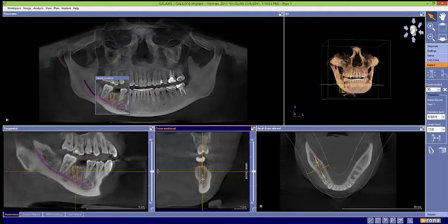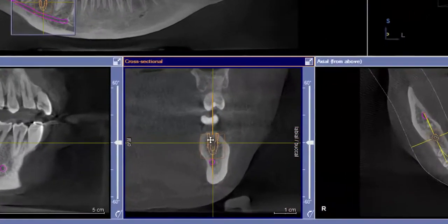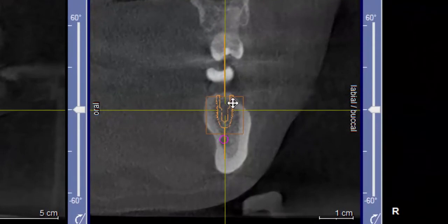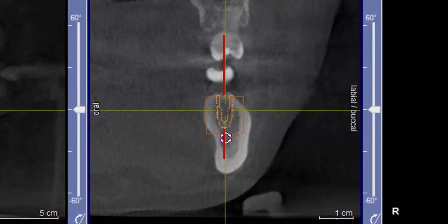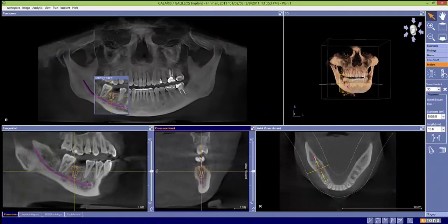To change the length, simply go to the right and select the desired length. Above and below the implant are the rotation lines. Simply grab on one of the lines, left-click, hold, and rotate as desired.